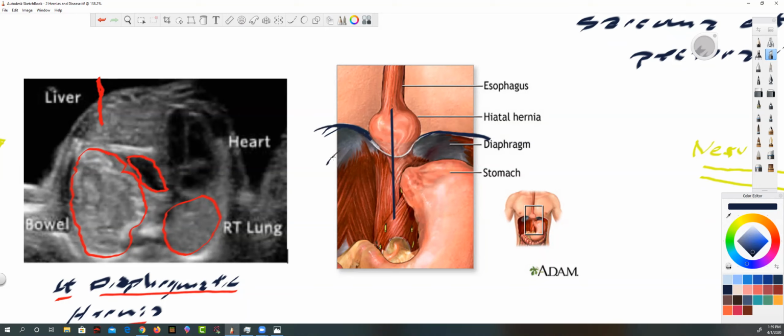And so the rib cage is coming up like this. And that's where we put our transducer to begin with. And one of the things that I got used to looking at, I started doing this 15 years ago before they were even really talking about it. I just noticed that on some people, you could see a lot more material than you should see. I'll grab an image to show you what I'm talking about.